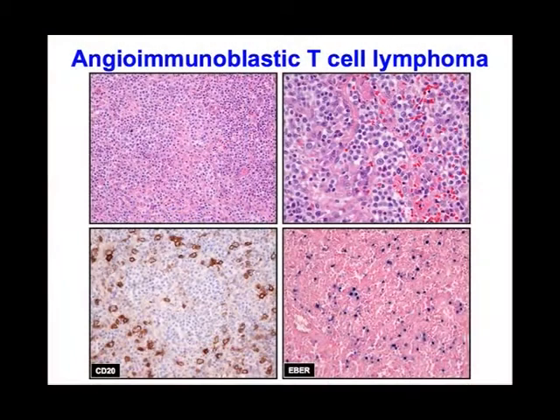Now, a very important point that people need to remember again is that we see an expansion of B-cell blasts in this disease. They're not malignant, at least in the majority of cases. And when you look for EBV, the EBV is not in the tumor cells, it's in these cells. So the EBV is harbored within the benign B cells, which are driven to proliferate. That's a characteristic finding. If you have enough of these, that's where if you do molecular genetics, you will find clonal B cell rearrangements. But don't be fooled by that.